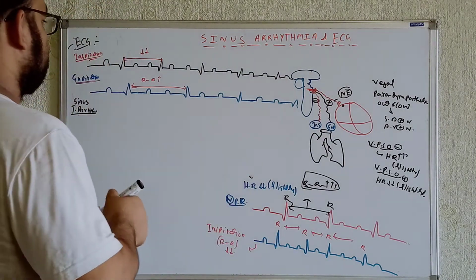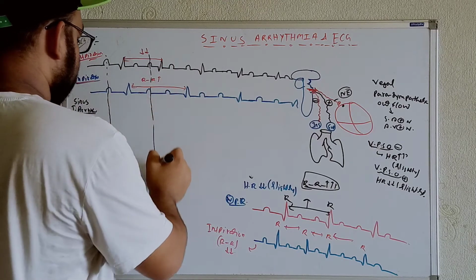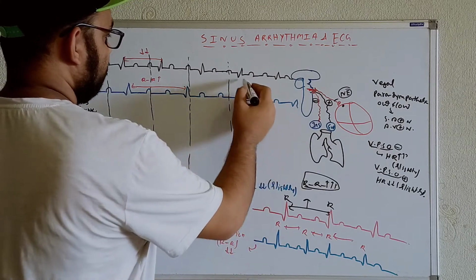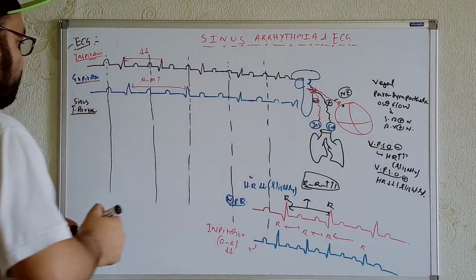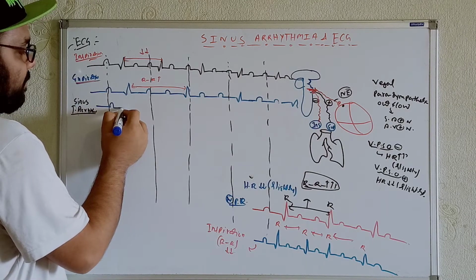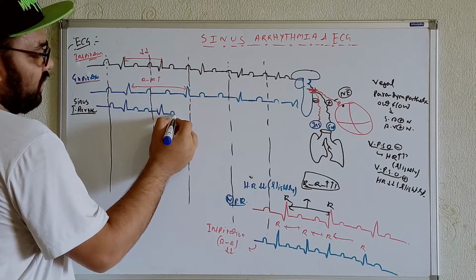Now if we just compare, the P wave over here. If we get the P wave over here, once again if we get the P wave once more over here. Now see again, for example, we got the P wave over here. In these cases there will be frequent P waves because that is causing the atrial contractions. So let's write it over here. First we will get the P wave, then again we will get the QRS complex, again we will get the T wave, again we will get the P wave, again the QRS complex, T wave, P wave again.